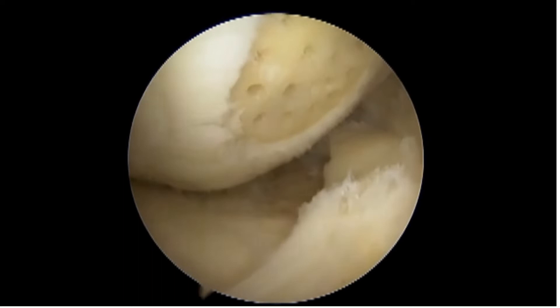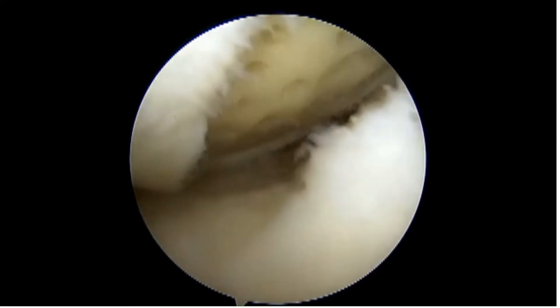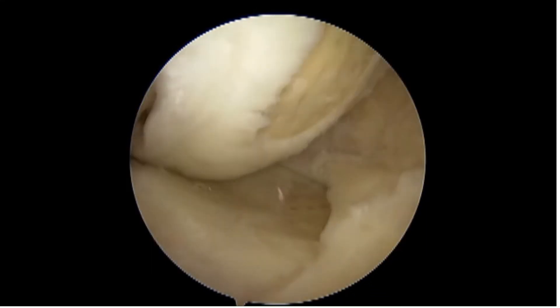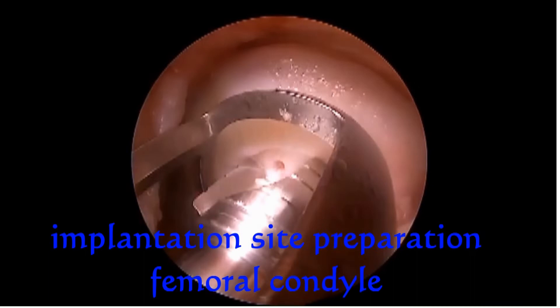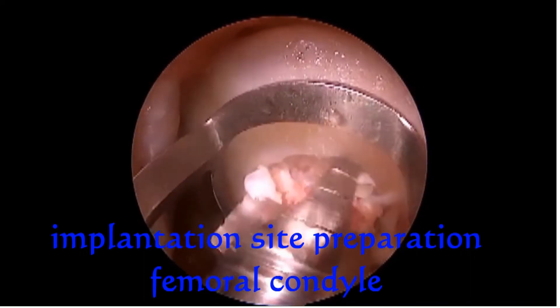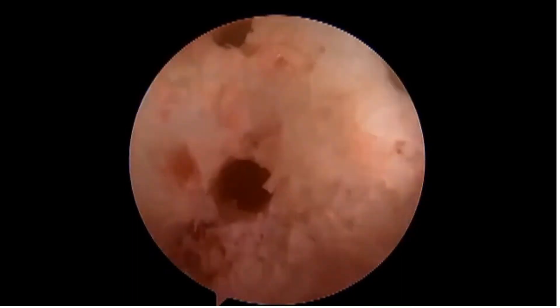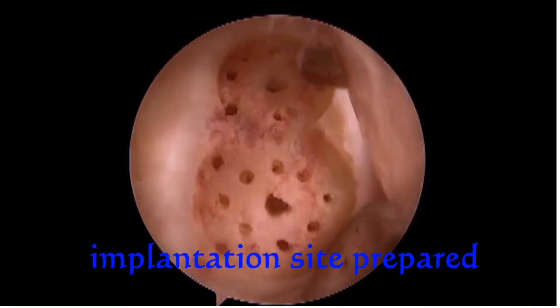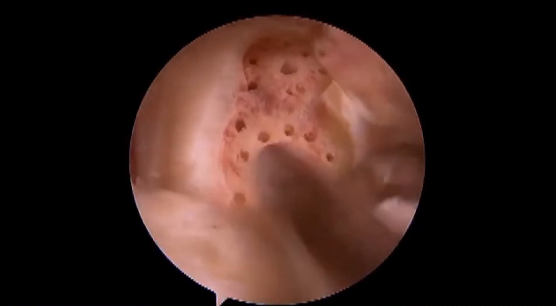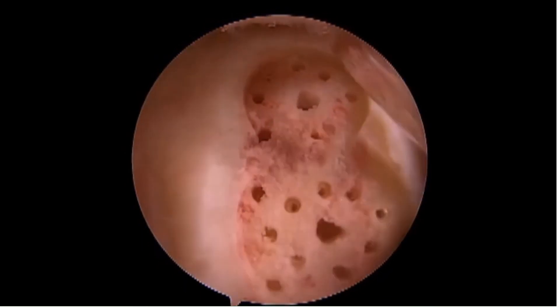After bone marrow stimulation was completed, the stability of the remaining cartilage was checked, all loose bodies were removed from the knee joint, and special thin Finceramica mini-invasive instruments were used to check and prepare the defect, and to implant the Myoregian Chondroplus scaffold into the defect site. Almost the entire medial femoral condyle was involved in this case.